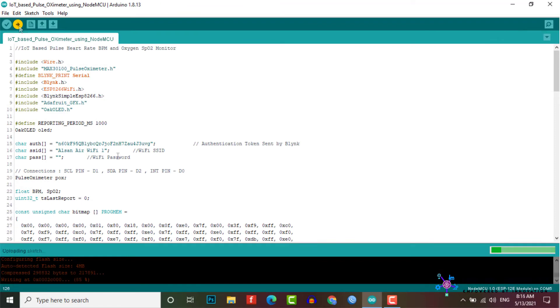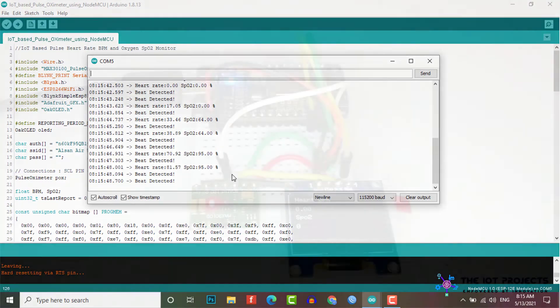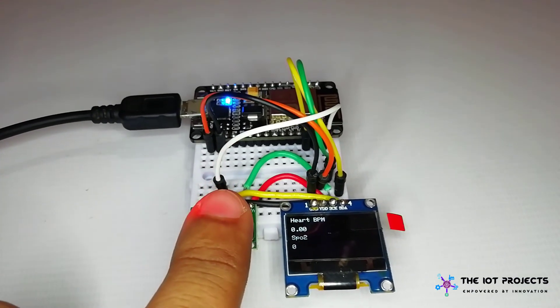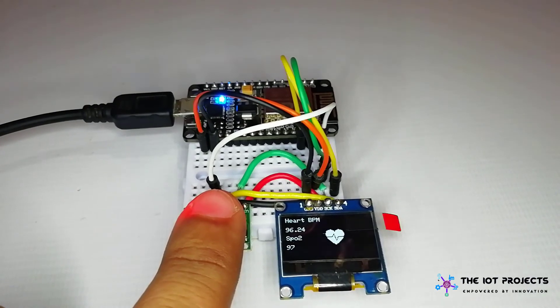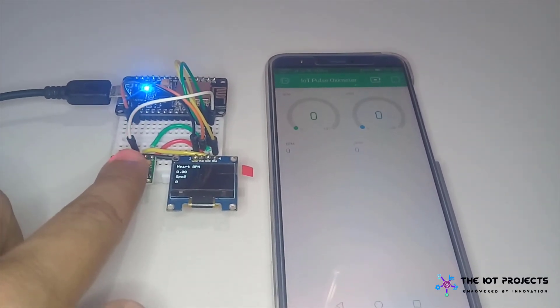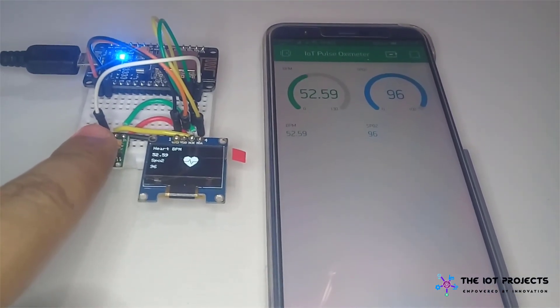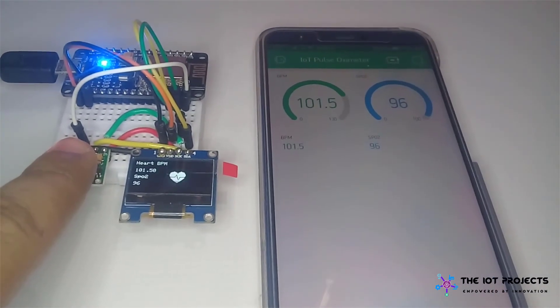After a successful upload of the program, simply place your finger on the sensor and it will display the values of pulse rate and oxygen level in your body. You can view these values on the OLED display as well as on your smartphone using the Blynk application. You can monitor your BPM and SPO2 values from anywhere in the world using the Blynk IoT cloud. That's all about the IoT-based pulse oximeter using the MAX30100 sensor and ESP8266 NodeMCU board.